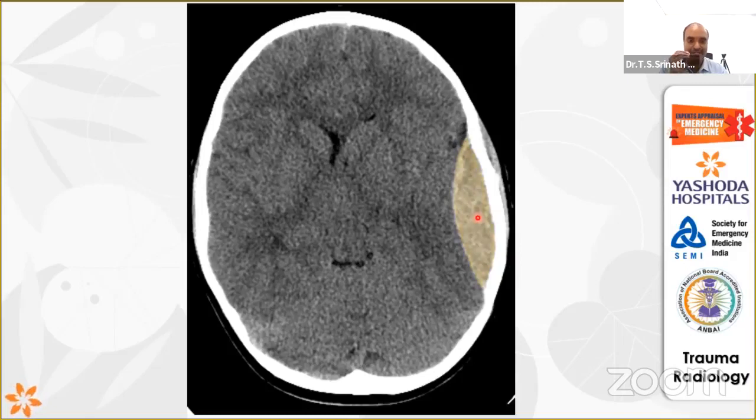If it is more than 3 millimeters, or more than 3 to 5 millimeters, it is a caution for you, an alarm for you. You have to activate your neurosurgeon and say, please, we need your support, because that is vital time. Whenever you suspect that the bleed is more, you get an alarm, and you should tell the neurosurgeon, I need your support. Whenever the ventricles are not seen, or whenever the opposite ventricle is also compressed, that means the alarm should be raised.